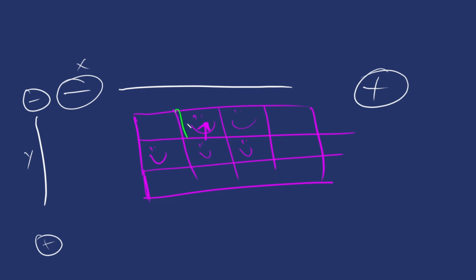Similarly, if we were to now start here and we're going to move upwards, there's no left to right. So this one sees nothing along the top because there's no left to right movement. But there is an up and down movement. In this case, since it's moving up, if we were to draw this here, it's moving towards the negative, at which point we'd have a negative deflection.